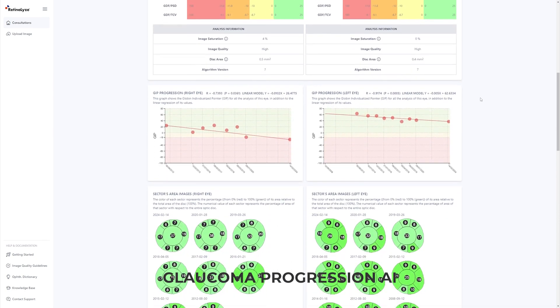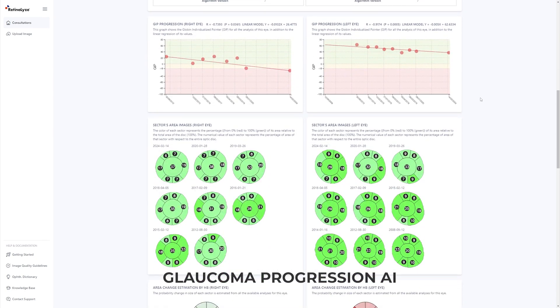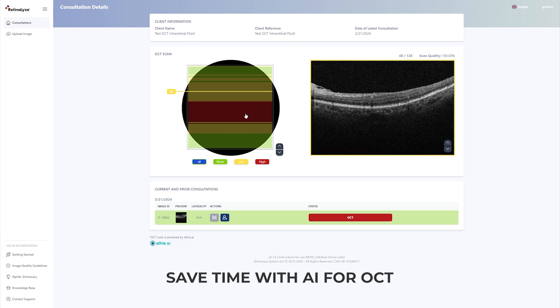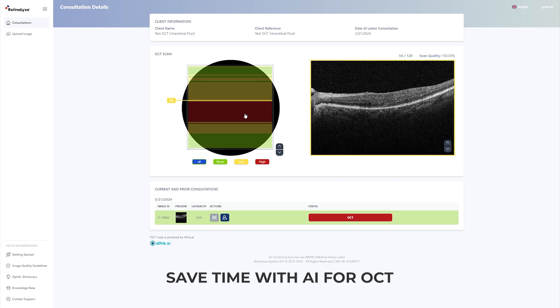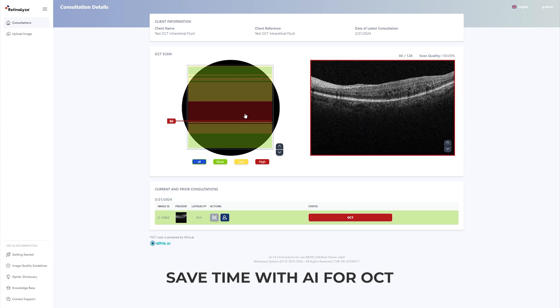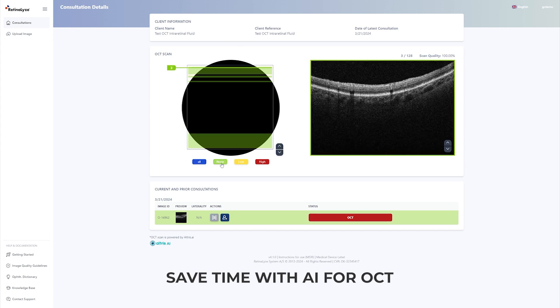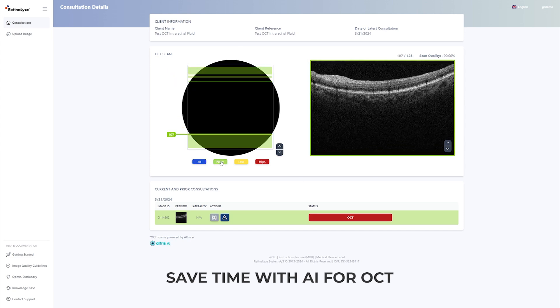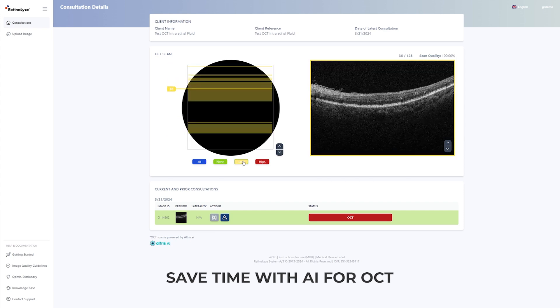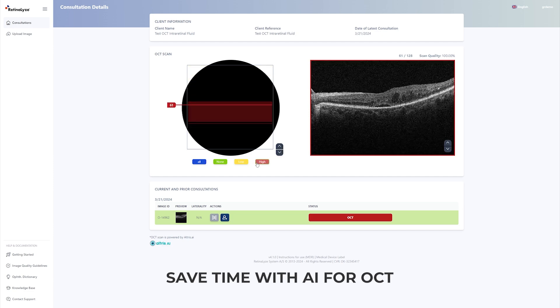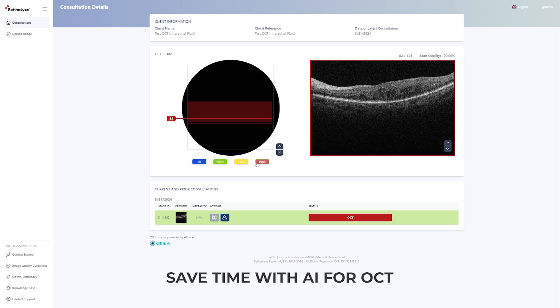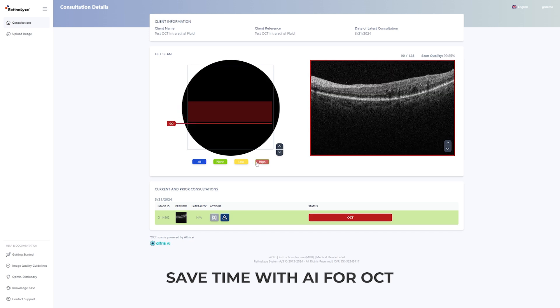For OCT, we do the same as for retinal images, but since an OCT scan consists of many individual scans, we save you time by highlighting the scans that need referral or further investigation. Here I'm selecting different filters to show the red signs of interest — in this case, retinal fluid.